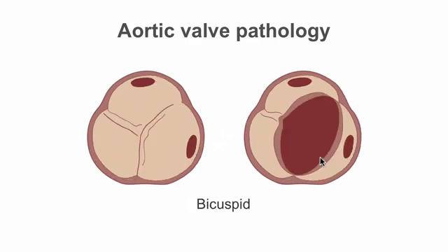As well as acquired aortic valve disease, CT is also useful at looking at congenital abnormalities of the aortic valve. In this example, we can see its use in looking at a congenitally bicuspid aortic valve. Note the fusion of the two valve leaflets, giving rise to a characteristic opening pattern which is similar to the appearance of a rugby ball during systole.